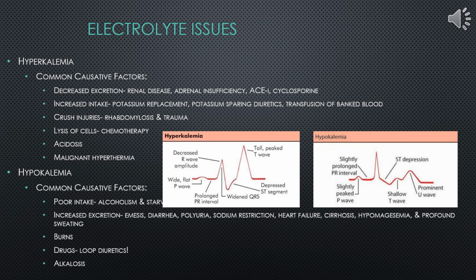I just wanted to touch on some electrolyte issues that are pretty commonly seen with EKG findings. This could be your potassium, magnesium, sodium, and calcium. So we'll just go over those real quick. I'll let you read all this information about hyperkalemia.